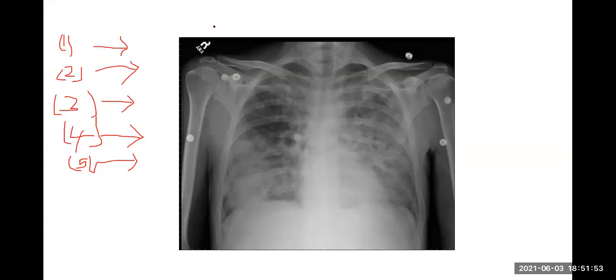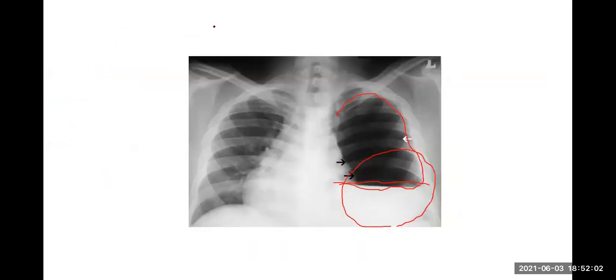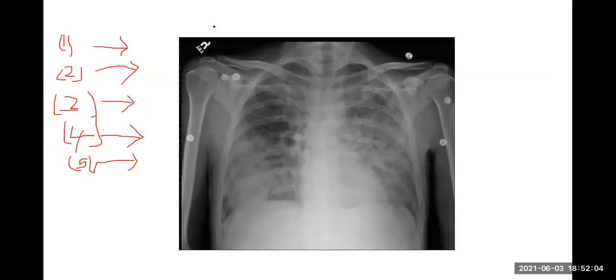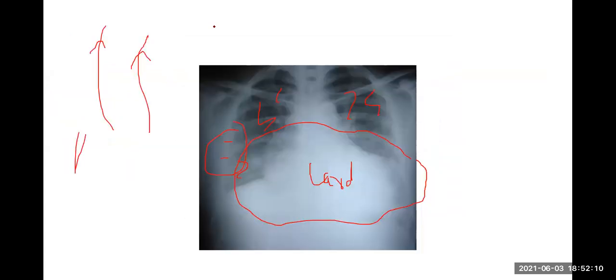So remember 5 differential diagnoses of a patchy sudu thing everywhere. And අපි මුලින්ම කතා කරේ මේ වගේ localized ඒවානේ ළමයි නේ එක පැත්තක හරි ඔහම තියෙනවා. Now we are moving on to patchy sudu everywhere. 5 differential diagnoses. Difficult to differentiate. Heart failure වගේ features තියෙනවා. ඒක වෙන් කරගත හැකියි. එතන ඉතුරු ඒවා history එකෙන් තමයි හඳුනා ගන්න ඕනේ. The rest you can use the history to differentiate.